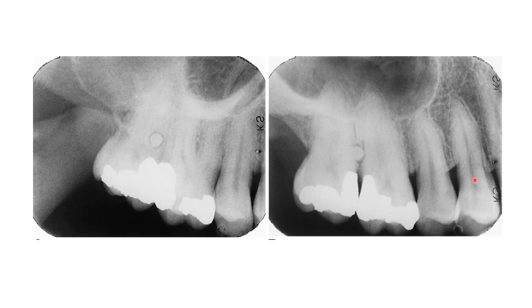Here is another example: a radiograph for the premolars showing teeth 14, 15, 16, and 17. We can see a radio-opacity located between the two molars, most likely an amalgam fill in that area. We can identify that it is located apical to the gingival region and exactly between the two molars, but unfortunately we cannot determine whether it is located closer to the buccal bone, in the middle of the ridge, or towards the palatal surface.